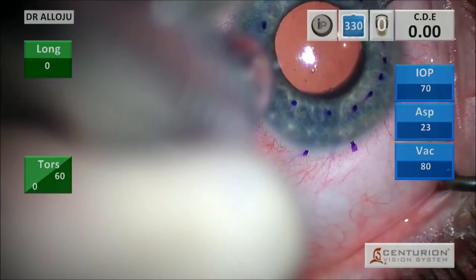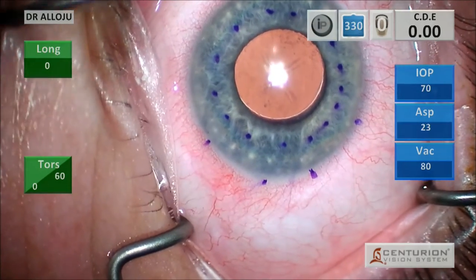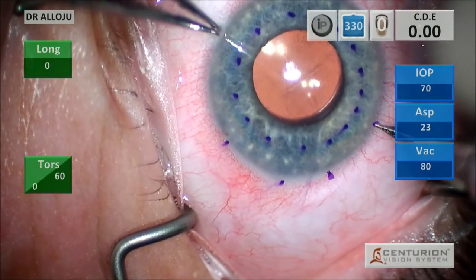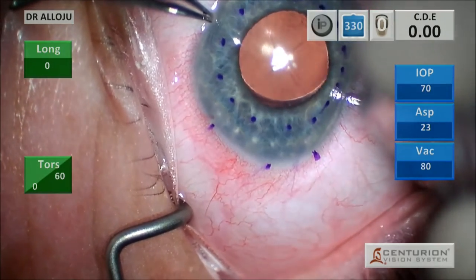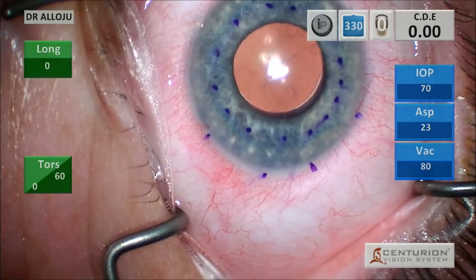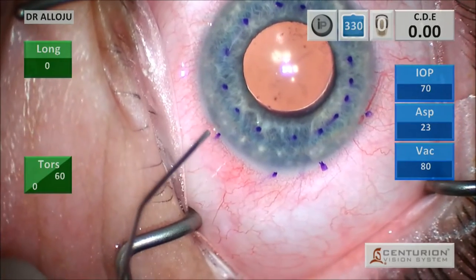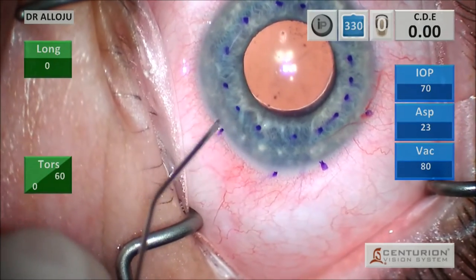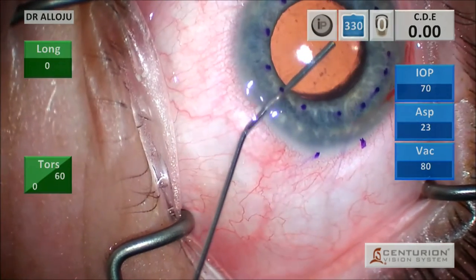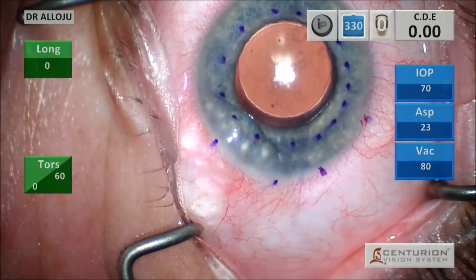So I start here by making a side port incision. And I'm using a 0.6 or a 23 gauge blade here. Now, I like to make sure that the internal lip is nice and open, so that allows me to maneuver my BSS or air cannula within the wound. You want to make sure not to use any kind of dispersive OVD, only cohesive. Here I'm basically just using ProVisc, not Viscoat.